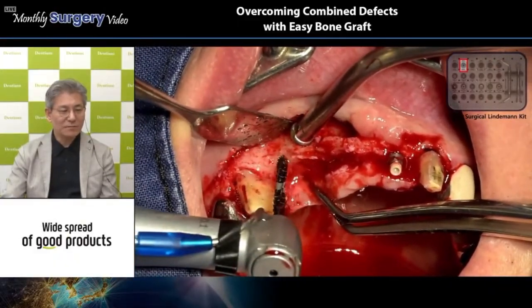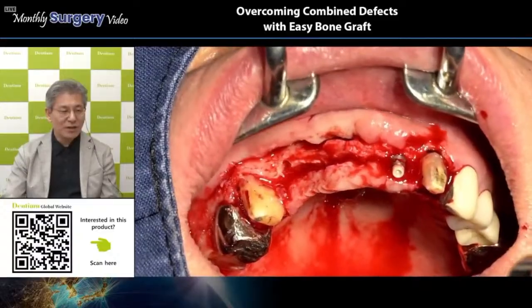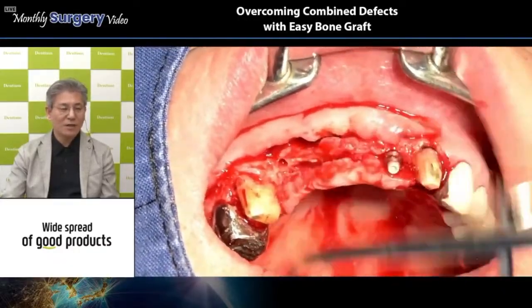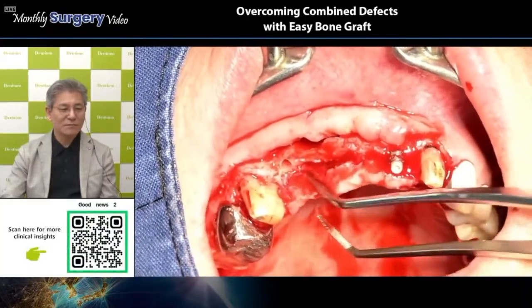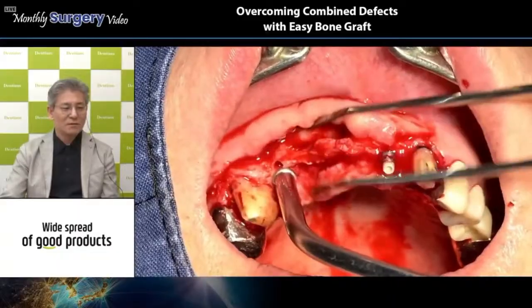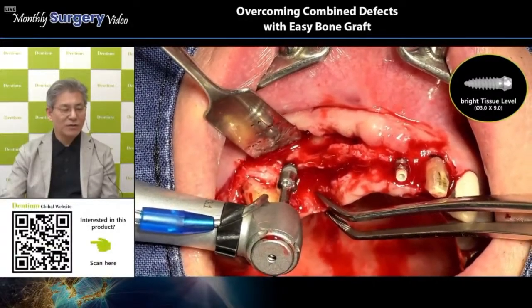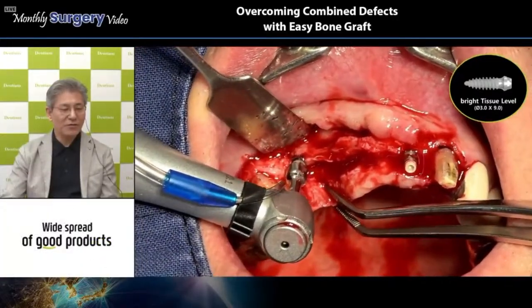Final drill here. This final drill has a Lindemann type shape, so it is efficient to make the osteotomy with the proper positioning, right? Nowadays, we have 3 different types of final drill kit available. A 3.0, 9 millimeter bright TL was inserted, this number 14 area.